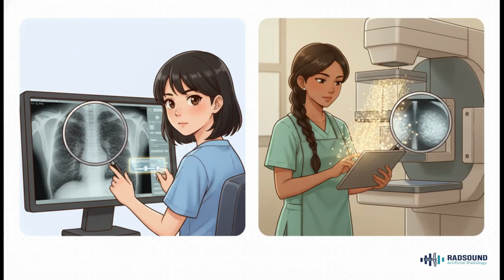Okay, here is another classic exam trap. People think that by fiddling with the window and level on their monitor, they're improving the image quality. You are not. Windowing just changes the display. It changes how you look at the information that's already there. It absolutely does not improve the underlying signal-to-noise ratio. You cannot create information that wasn't captured in the first place.